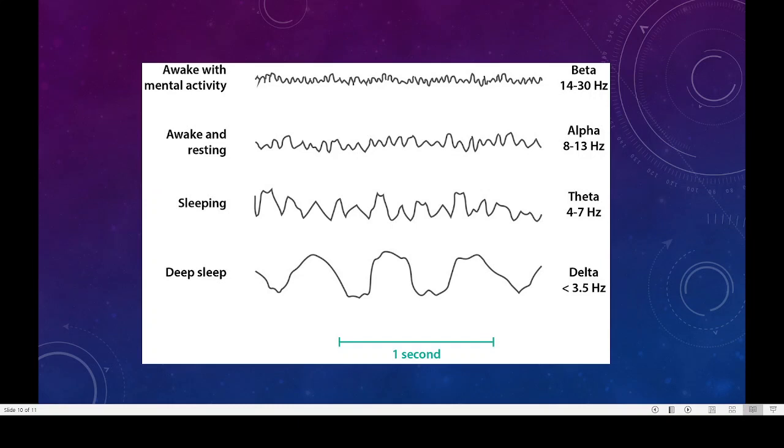You can see that they are usually generated during deep meditation and in a dreamless sleep. When you are in a deep meditation, this is how the delta waves appear. These are the delta waves. So when you are in a deep sleep or a deep meditation, our brain is producing this sort of brain wave, and they are generated in deep meditation and dreamless sleep. Healing and regeneration occur when the brain is in this state.